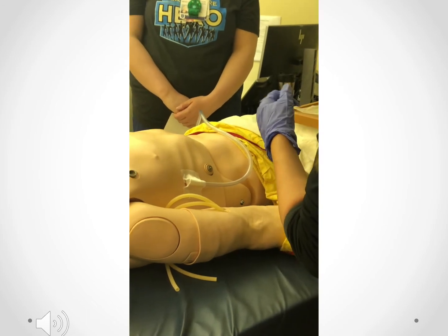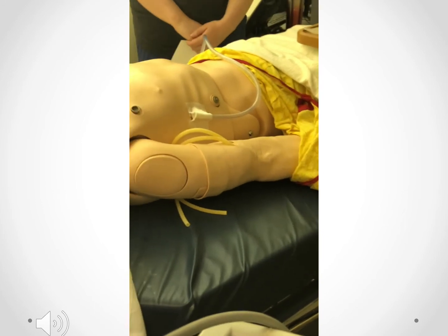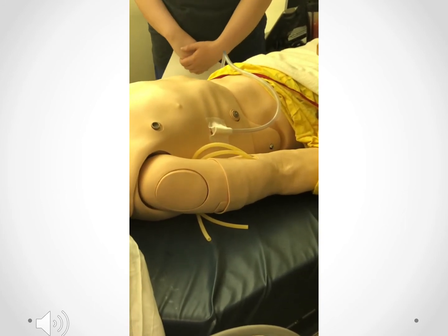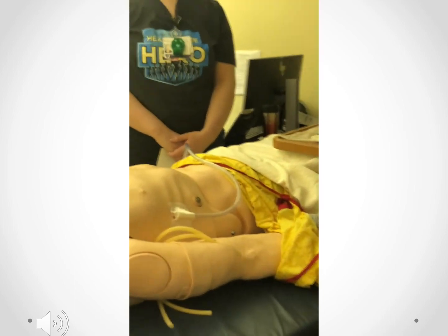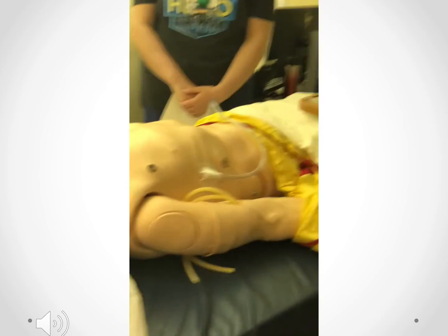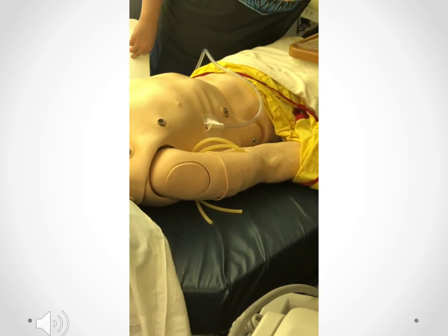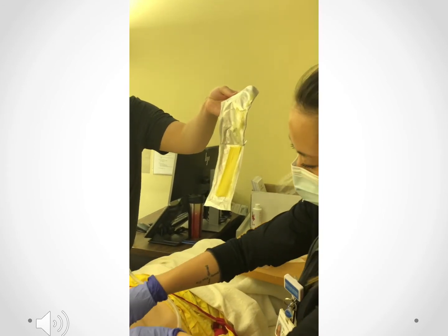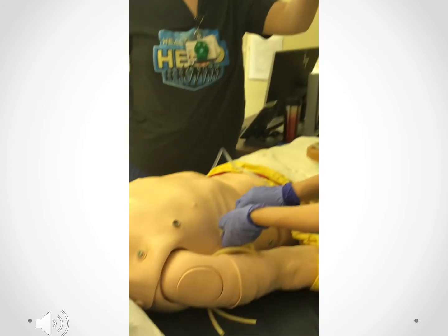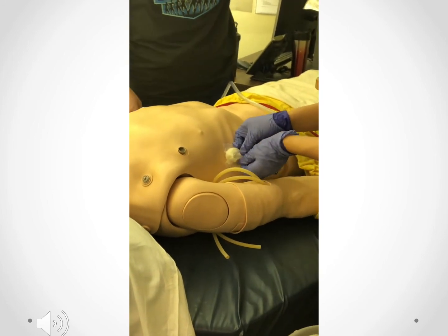Now Katie will place the xeroform. However, for the purpose of this video, we will not actually be placing the xeroform on the mannequin. Given the nature of the xeroform, we'll substitute it with this other gauze. However, we usually use this yellow xeroform, as you can see here. And we take it and we wrap it around the chest tube site so that it completely circles around the tube at the insertion point.